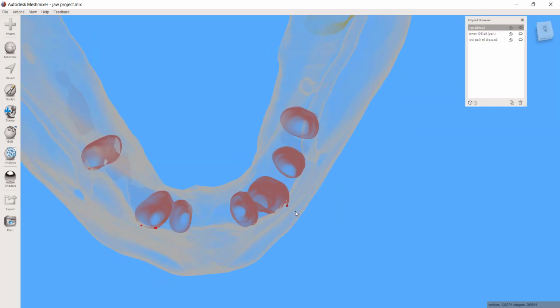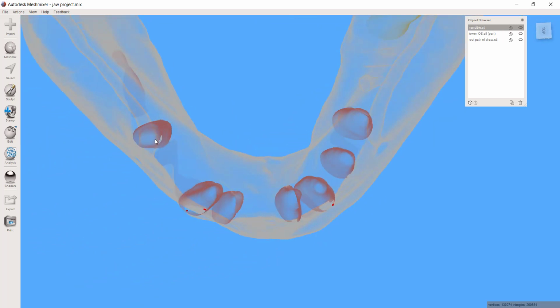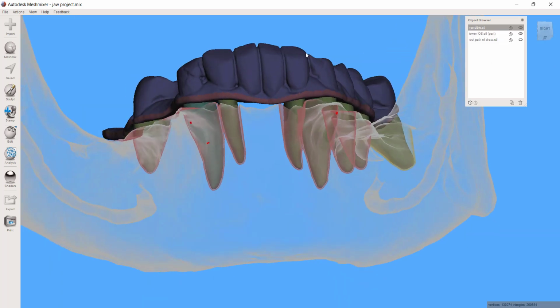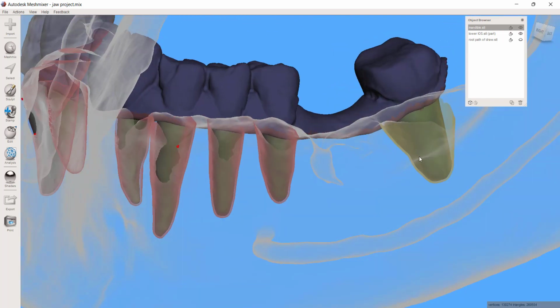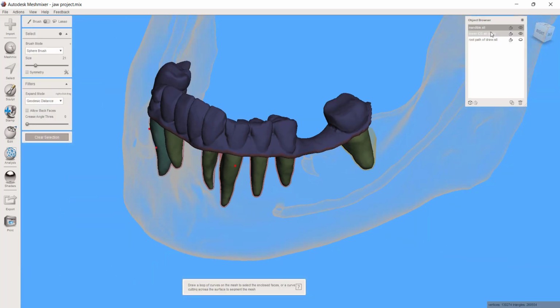So what I'll do is I'll just take a paintbrush with some of the same resin in its wet form, and I'll just brush some in there, okay? And then before curing it, I'll take this, press it down until it's fully seated, and then I'll throw them all in the curing oven together and let that cure. And now you've got a great study model. And if after the fact, when you come back, you still see that there's significant gaps, just flow a little more resin in there until you're back to more or less a full contour mandible. You'll never get these separated again, but that's okay, right? That's kind of what we're after really in this process.